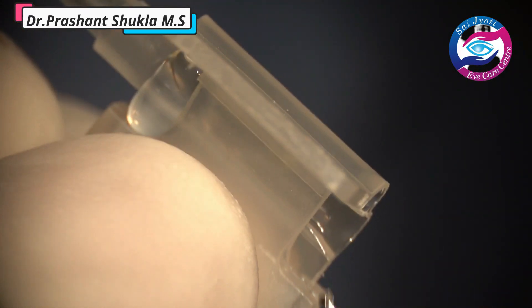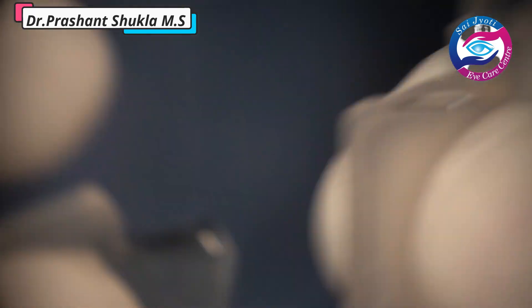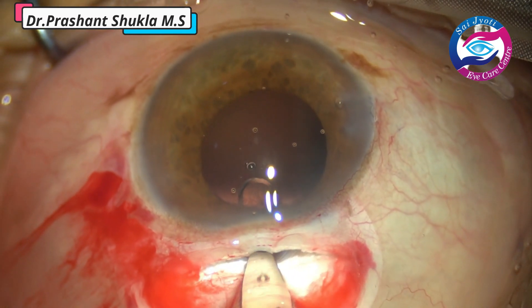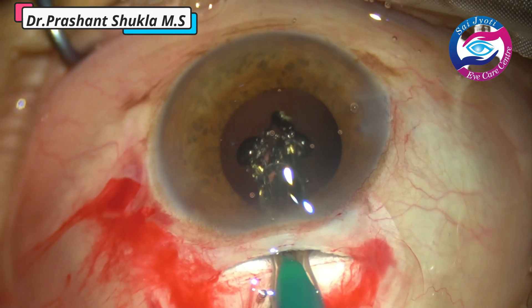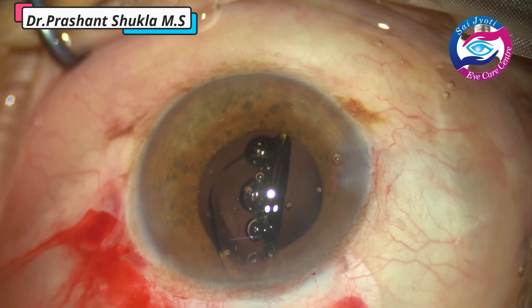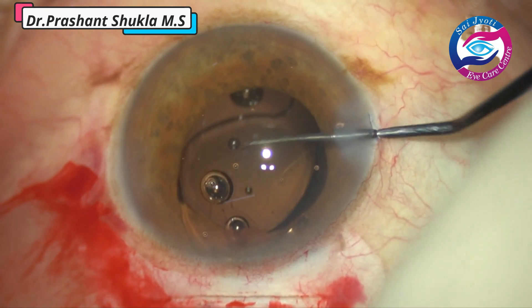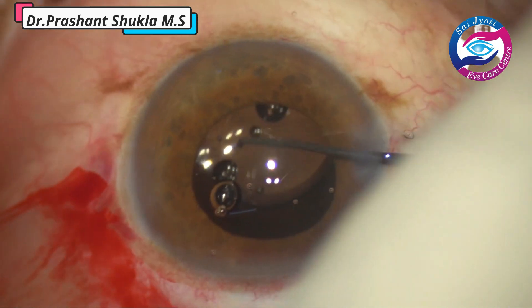In this case I am implanting a semi-preloaded intraocular lens — hydrophobic, from Appa Swami, no financial interest. The lens has already been loaded into the cartridge; we just have to put the viscoelastic and remove the knob. Lifting up the anterior lip of the wound slowly, we inject the intraocular lens into the eye directing the haptic into the capsular bag. After the lens is in the eye, a Sinski hook holds the optic-haptic junction and gently dials the other haptic into the capsular bag.